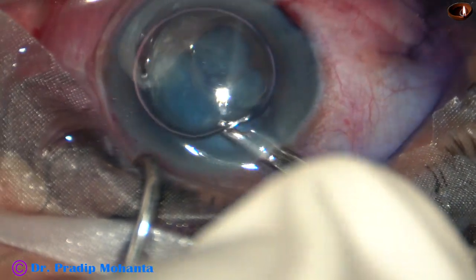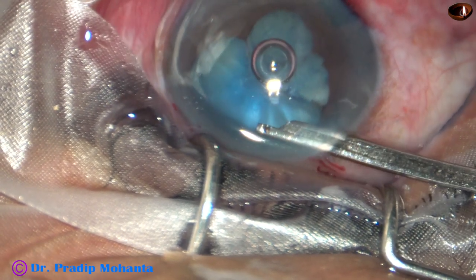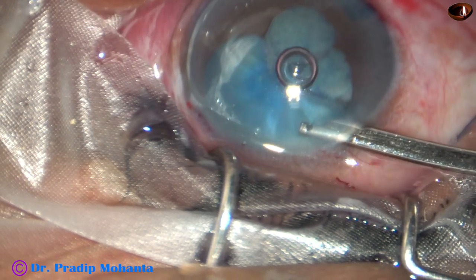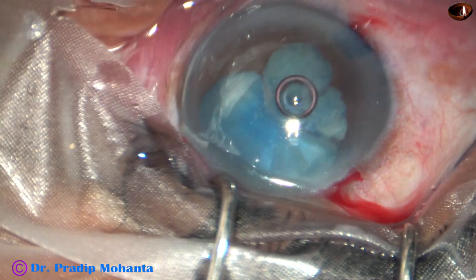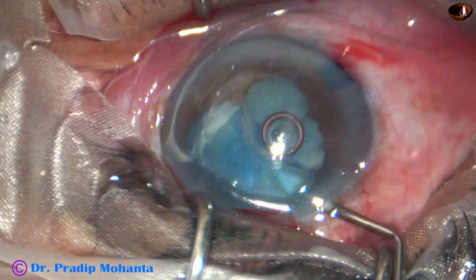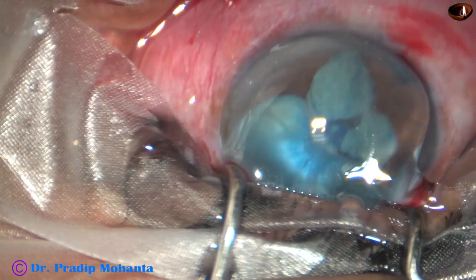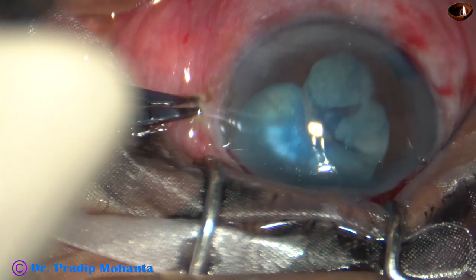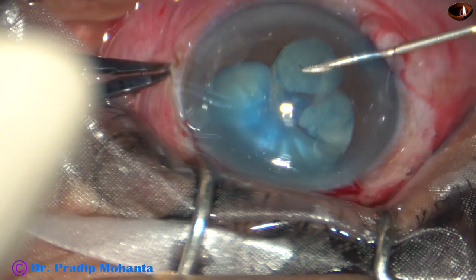The dye is washed out nicely. Then 2% hydroxypropylmethylcellulose is injected to fill the anterior chamber — this is 2% HPMC viscoelastic. The visco is also applied over the cornea for better visibility. Here you can see intact capsule on the left side and the torn margin and the cortex on the right side.